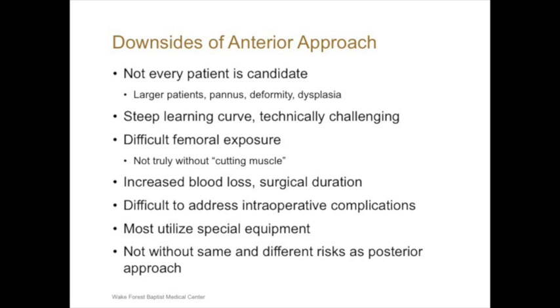One of the complications can be fractures of the greater trochanter or fractures of the femur. The posterior approach is kind of our workhorse approach. It's really easy to extend it to address any complications. But from this approach, it's a little more difficult because you're kind of locked into this table. If the incision is extended, it's more difficult to address any issues from that position, whereas a posterior approach is much easier to address anything.